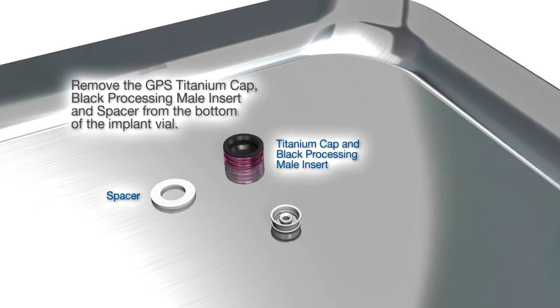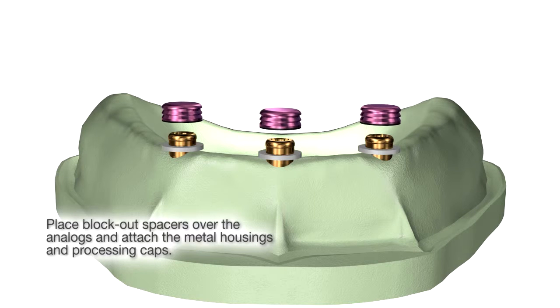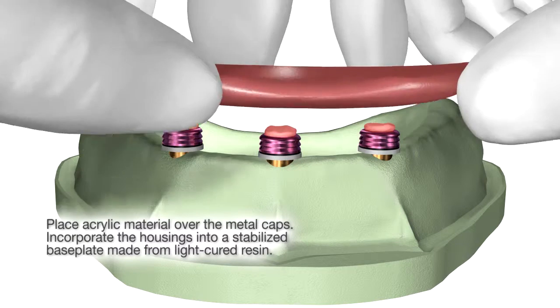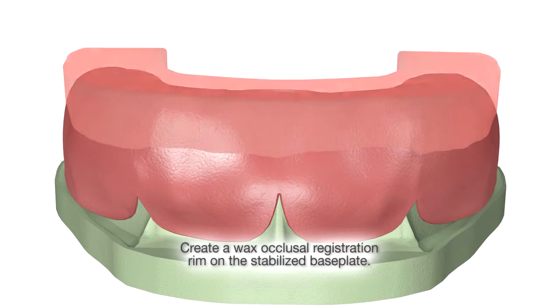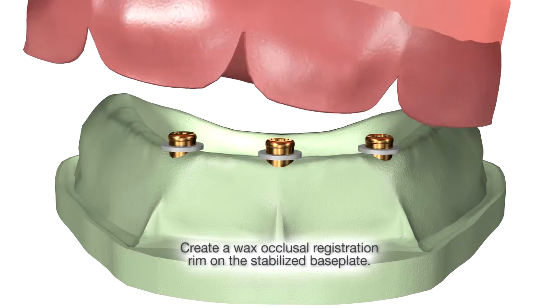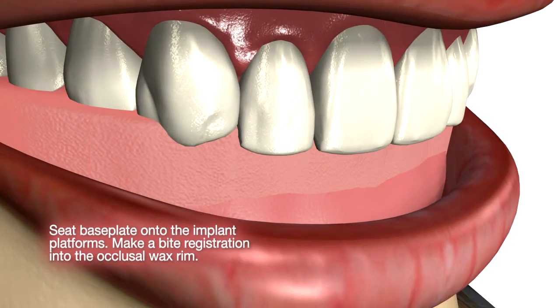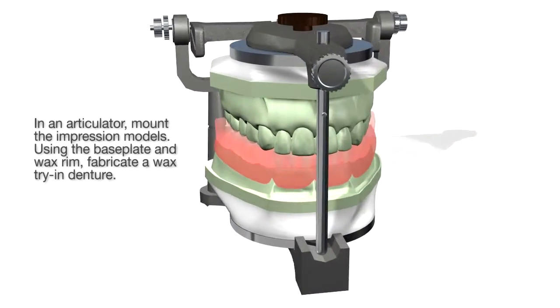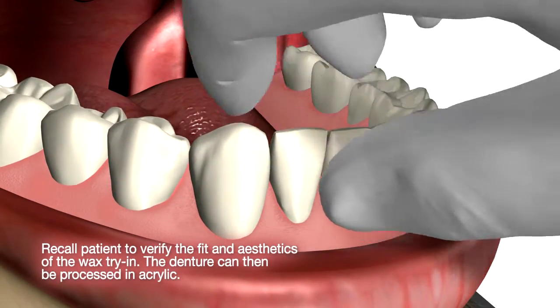Metal housing and the black insert and the spacer are used for either a chair pickup in a reline, or in this case we're going to manufacture a base plate, stabilized base plate to take the bite registrations. Mount the working cast on an articulator, set the teeth up for a wax try-in. Come back and check the aesthetics and occlusion of that denture base.